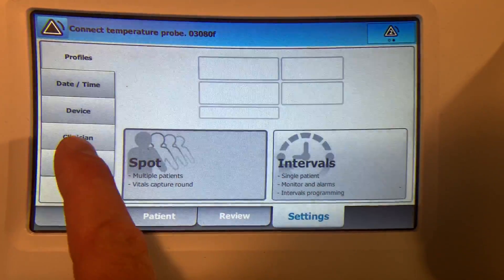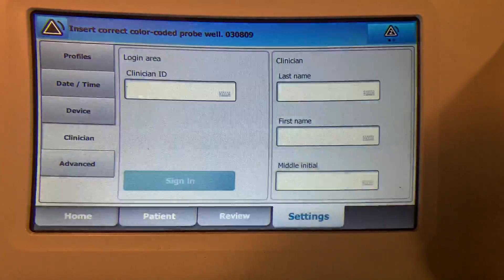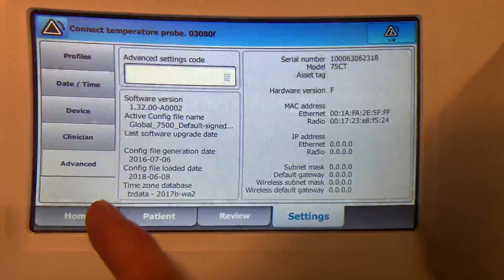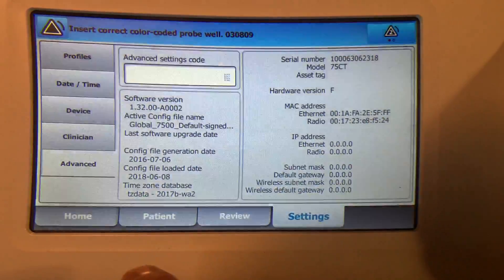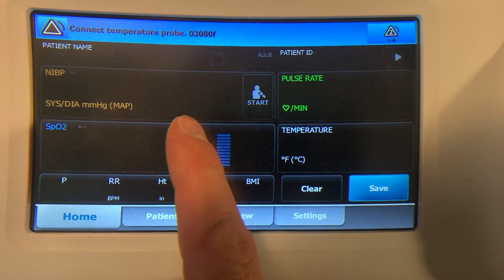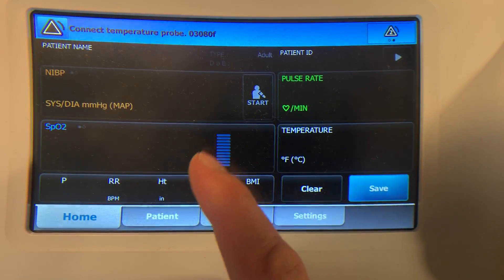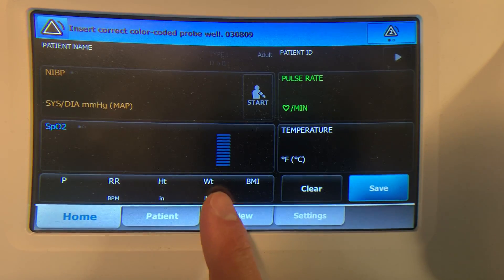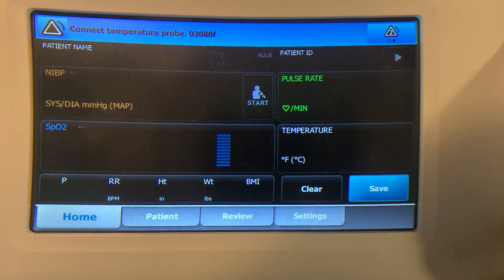You can set the date and time. If you have an active directory set up, you can log in as a clinician. There are advanced settings as well where you do your networking. If you go back to home here, you'd have the main controls where you could start reading — you could start a pressure check and you would see all the other information there.